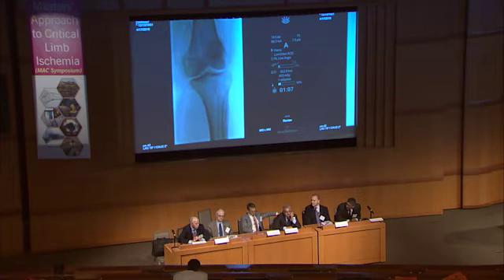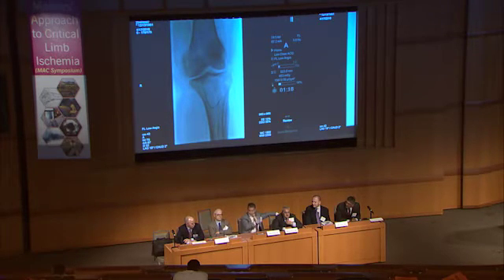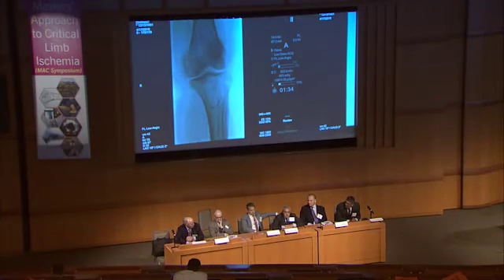I'm sure it makes you slightly uneasy. Is that right? Well, there's a lot of issues with the Viabahn. One thing is you always want to prep the vessel well and make sure that you can get the device fully expanded, because it's not like other nitinol stents. If you're oversized or in an area where the vessel's not well prepped, you will get infolding of the graft material and a higher risk of stent graft thrombosis. So vessel prep's important. Ideally, cover the lesion entirely.